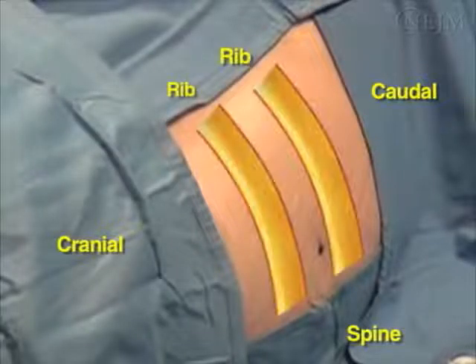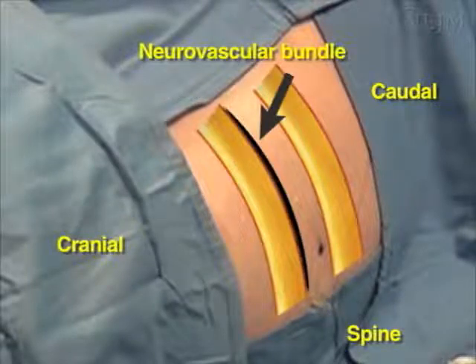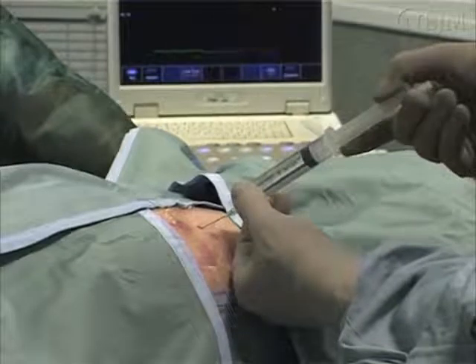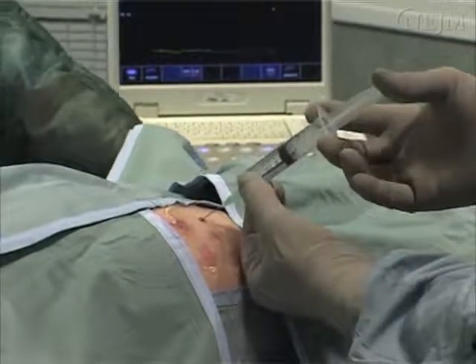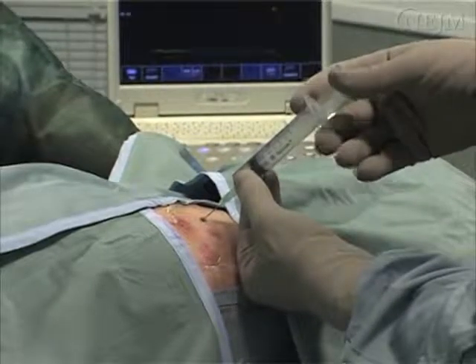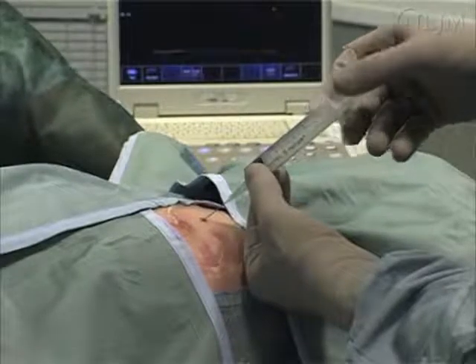The needle must be inserted in the intercostal space on the top of the inferior rib in order to avoid the neurovascular bundle, which lies beneath the lower edge of the rib. Using a 10 milliliter syringe with lidocaine, create an intradermal wheal where the skin has been marked. Anesthetize the superficial tissue and then the deep tissues. Gently aspirate at frequent intervals, checking for blood, to prevent any inadvertent intravascular injection of anesthetic.